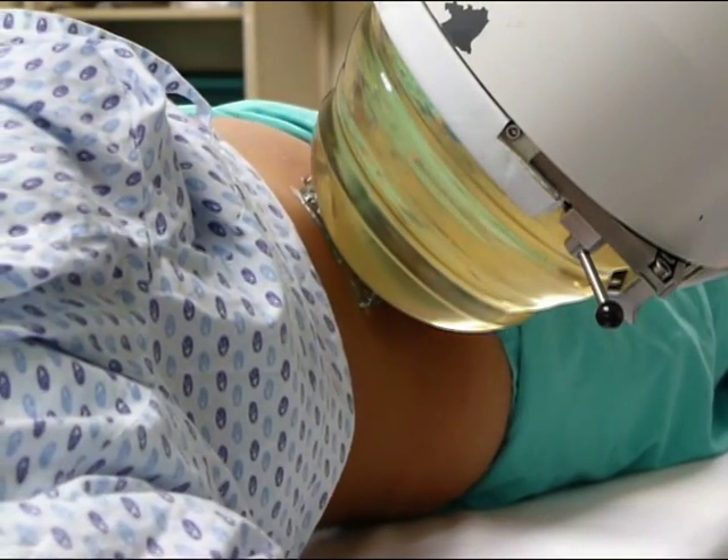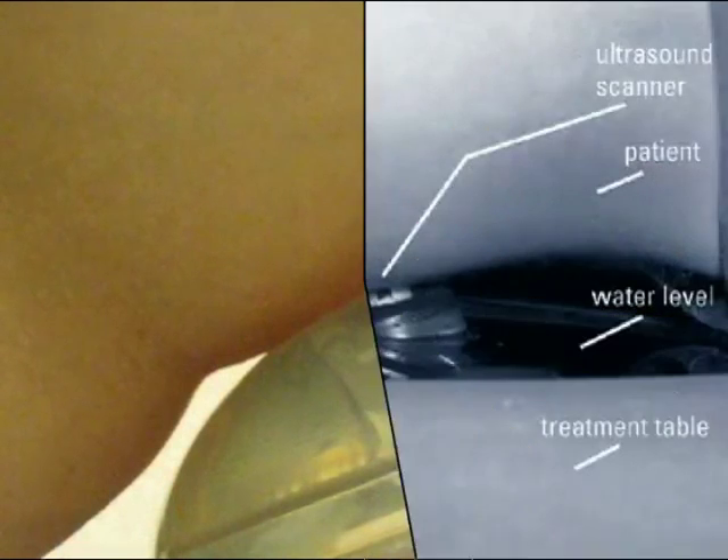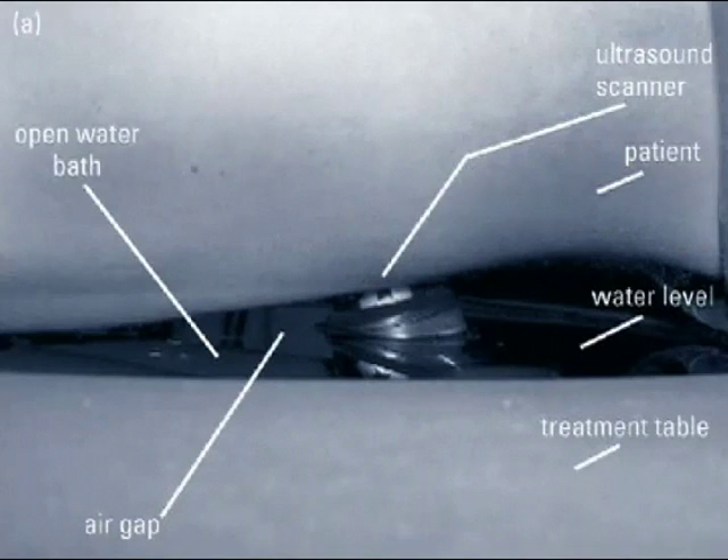Another important factor regarding patient positioning for ESWL is that passage of the complete shock wave cone should be assured. The video shows that only a small part of the total energy produced by the shock wave source is coupled into the patient. In open-bath lithotriptors, ultrasound scanners should not exert too much pressure on the patient's skin, since this could result in a water-air interface.